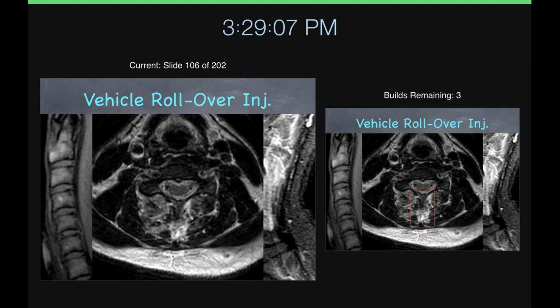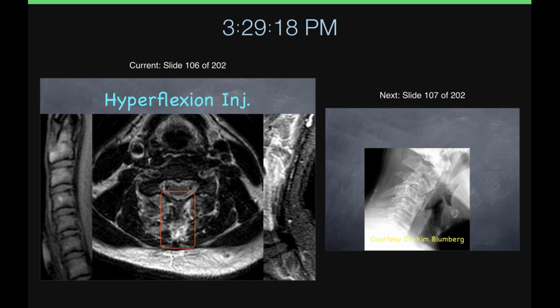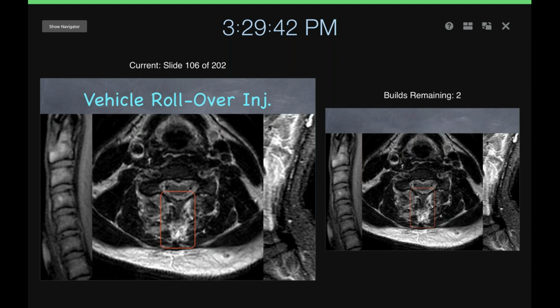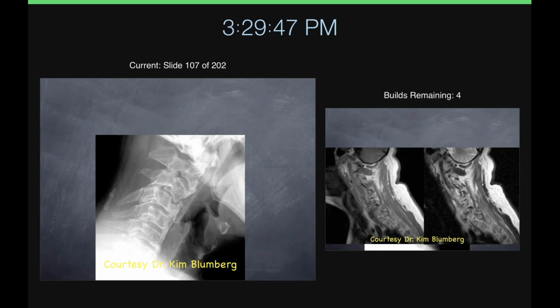There's the axial image through there. Axial. Fracture of the tip of the spinous process, some edema in the muscles. Okay. Right. So this was a hyperflexion injury, and it actually tore the muscles, and it also tore the interspinous ligament between the spinous processes. And we can see the widening of the interspinous processes here. The central column and the anterior column look like they're grossly intact. But there you can see the posterior changes from the hyperflexion injury.